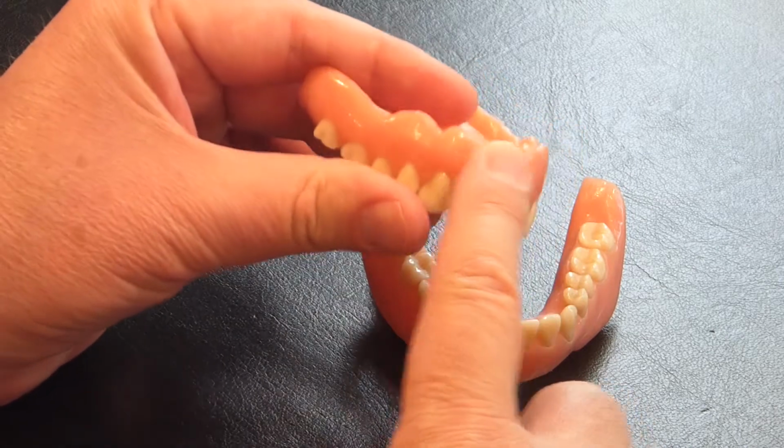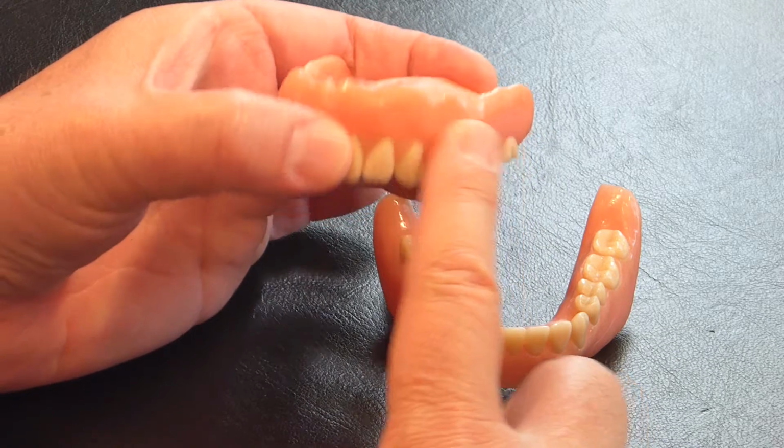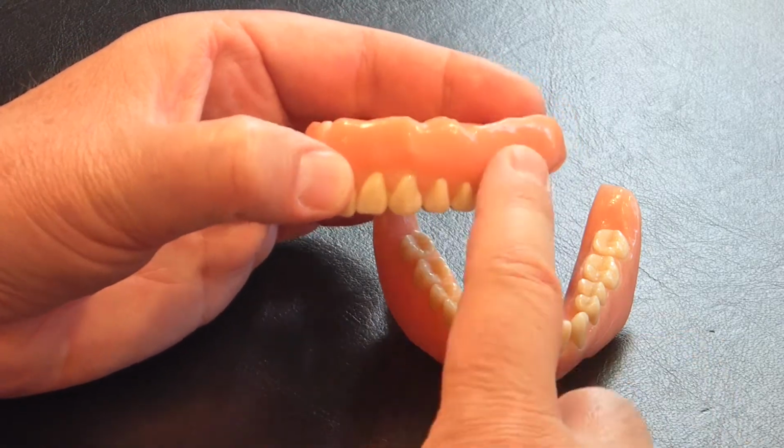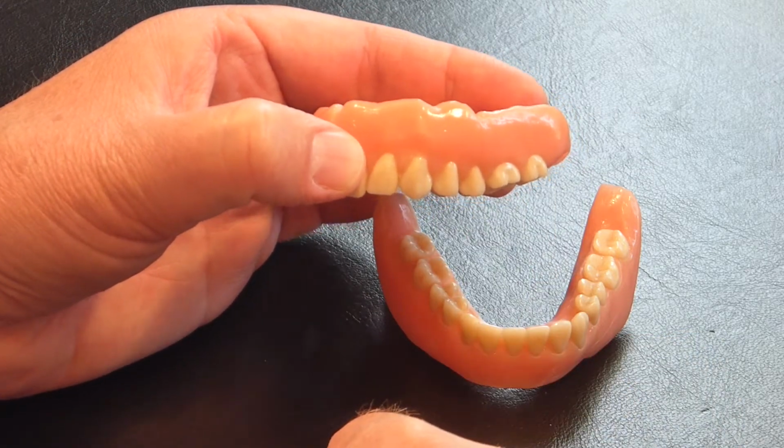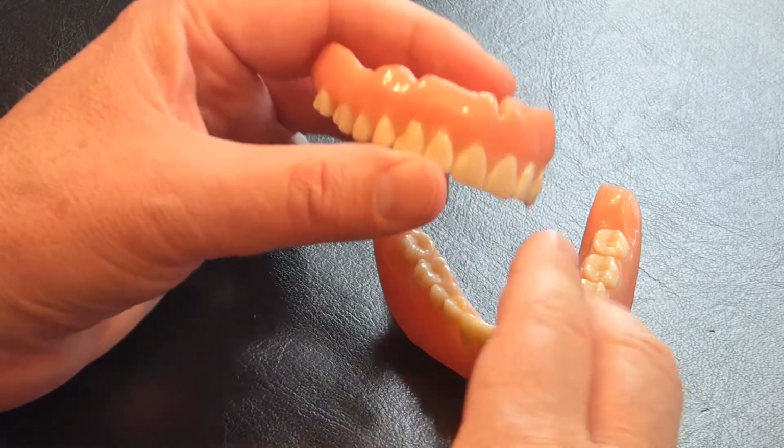The acrylic itself, general shade is a pink, but it comes in different shades of pink, so we can even go very dark shades of pink to help match the person's complexion better.